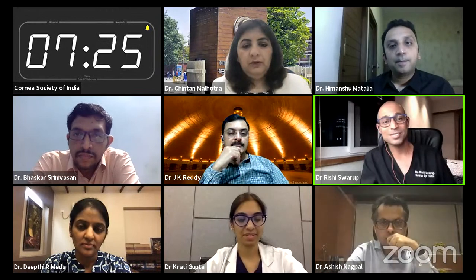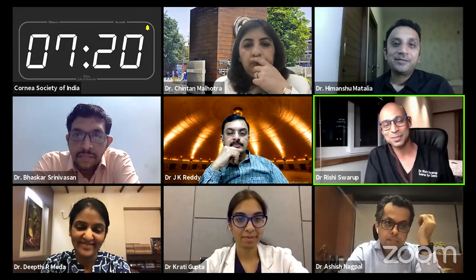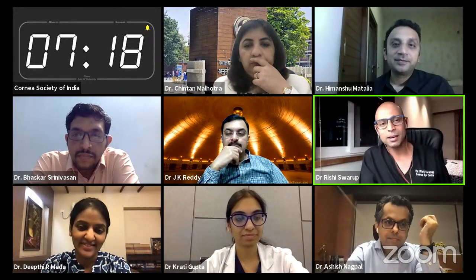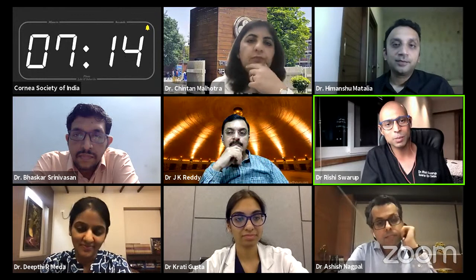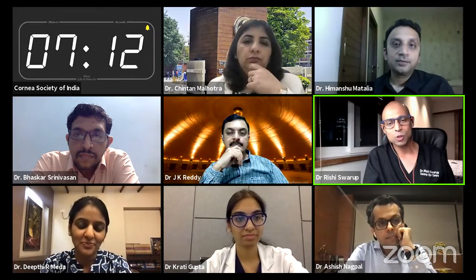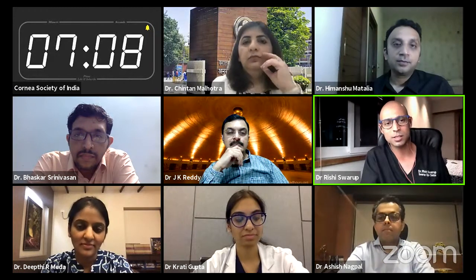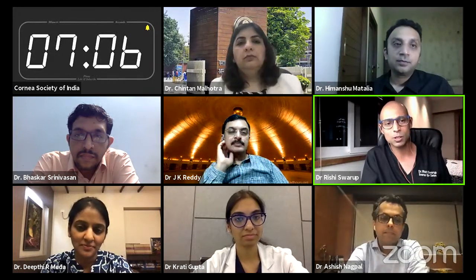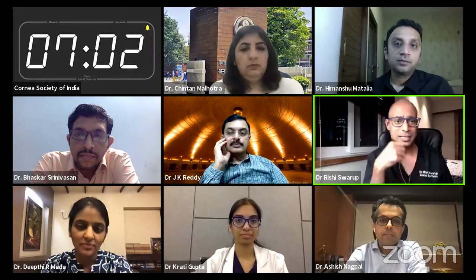Deepti, your series is very interesting. I have not had the guts to go beyond 6 diopters. And my guess is that it's not that the machines don't have the ability to treat beyond that. They have particularly stopped it at that because there are concerns, and there have been reports that beyond 6 diopters, your chances of spherical aberration are much higher. You can end up with decentered ablations.